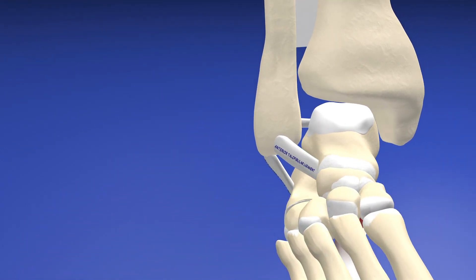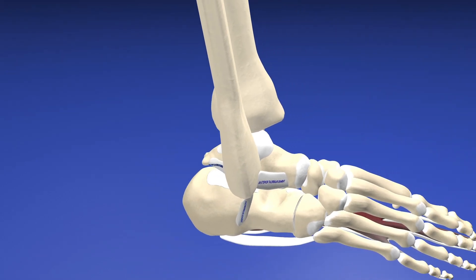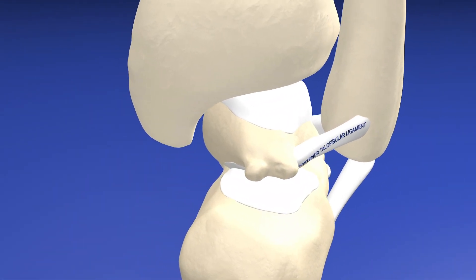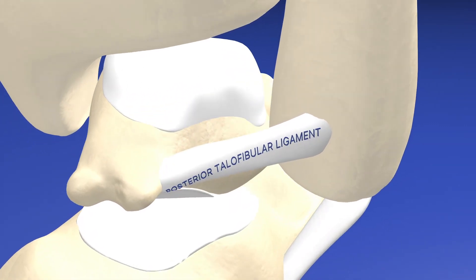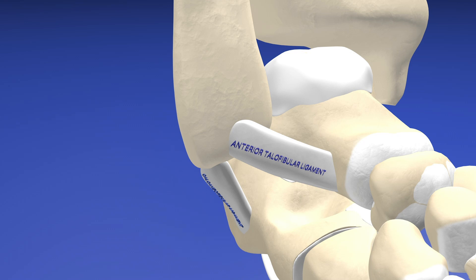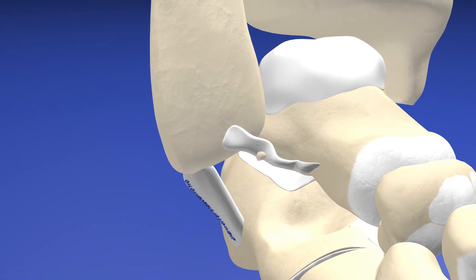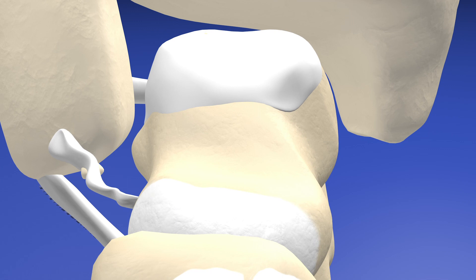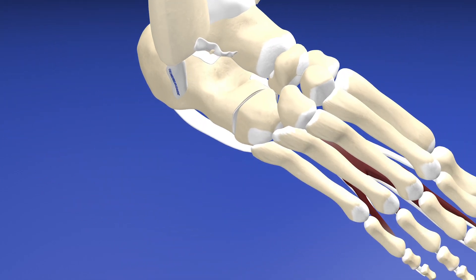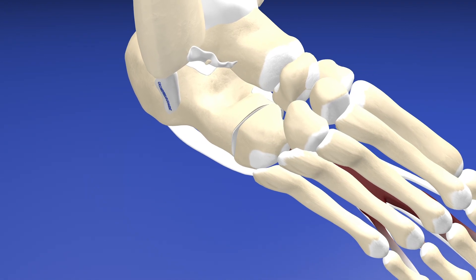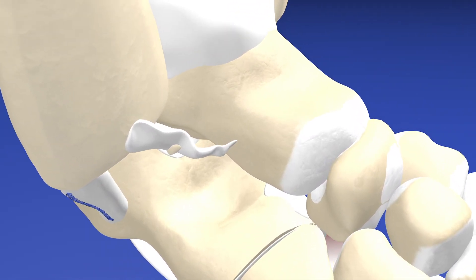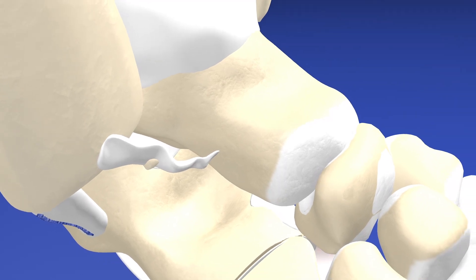Here we're going to review the anatomy of the lateral aspect of the ankle. You can see the normal anterior talofibular ligament, calcaneal fibular ligament, and posterior talofibular ligament. We're going to change the anterior talofibular ligament into a high-grade partial tear, mainly with the distal fibers as they begin to insert on the talus. There's a waviness to the ligament, also thinned — especially near the distal aspect near the talus. You can also see a loose body within the substance of the ligament.